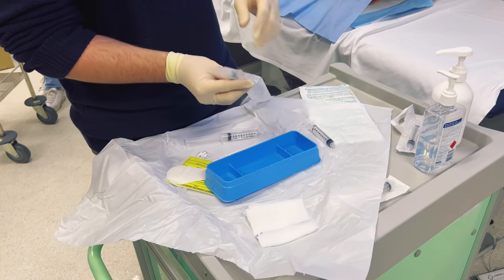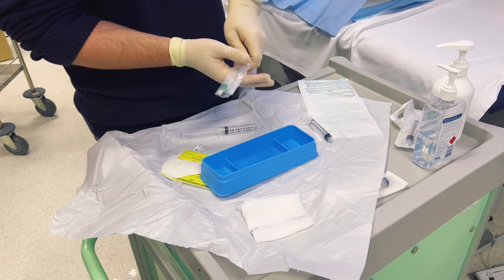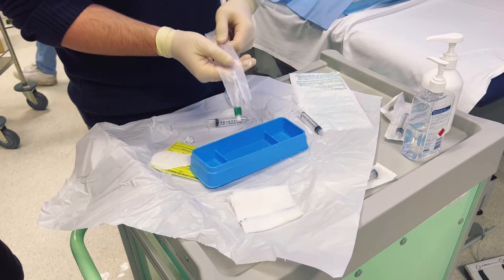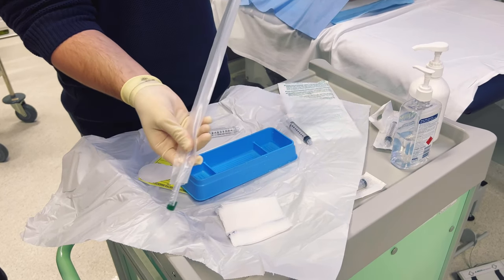We learned a variety of steps involving cleaning the area, applying local anaesthetic in the form of a gel, placing the tube, checking it was in place, and balloon inflation and deflation.